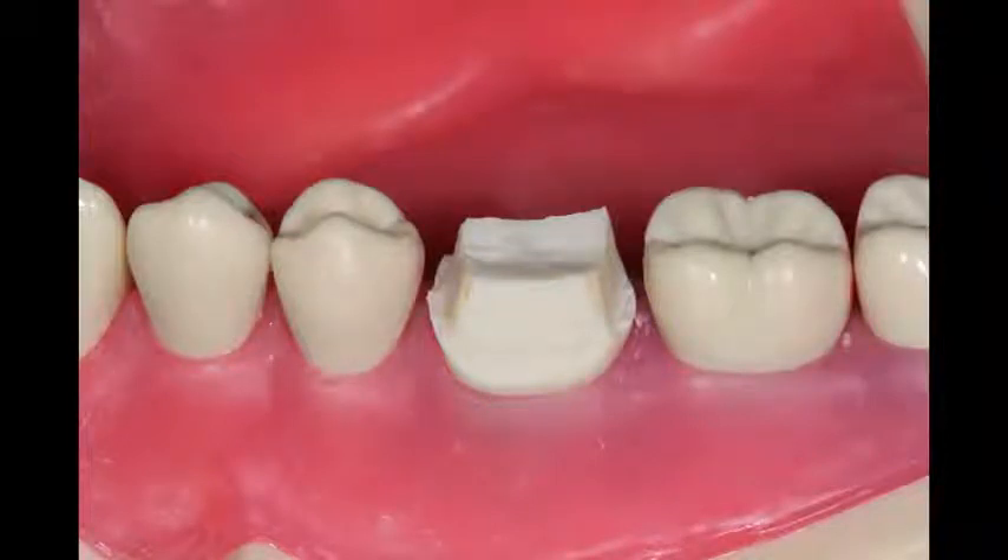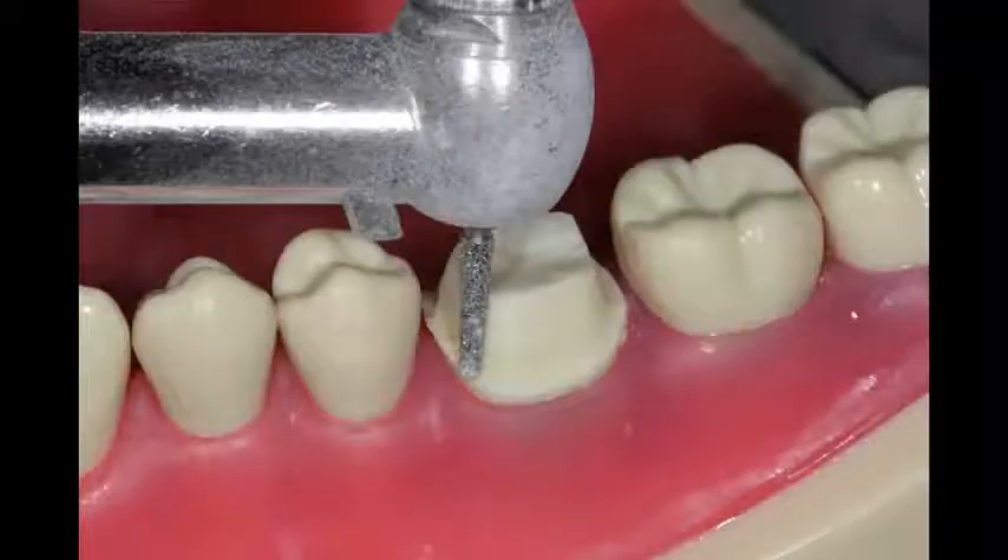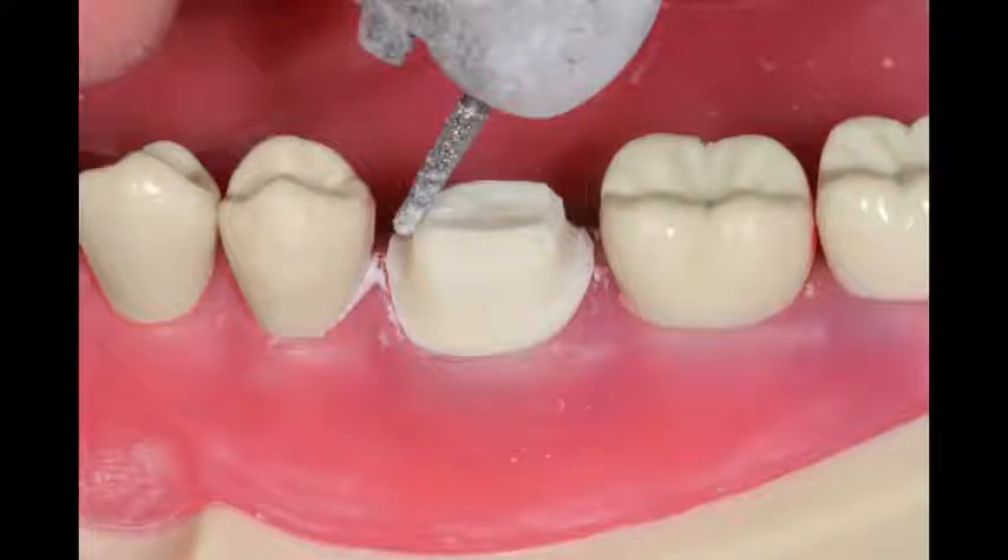After I've got that basic prep design finished, it looks kind of squarish from the occlusal. So now it's time to round the line angles, again using just a regular shaped diamond burr. I will also reduce the occlusal line angles to a two-plane reduction.